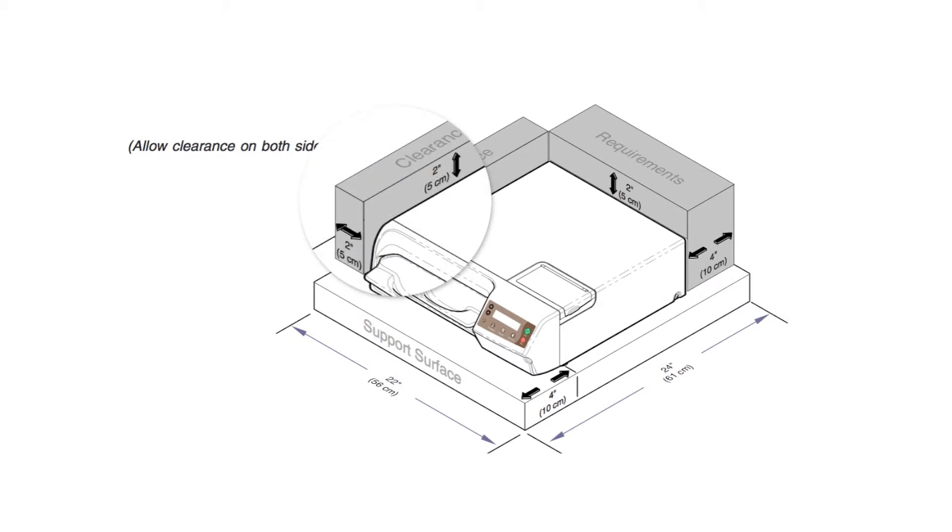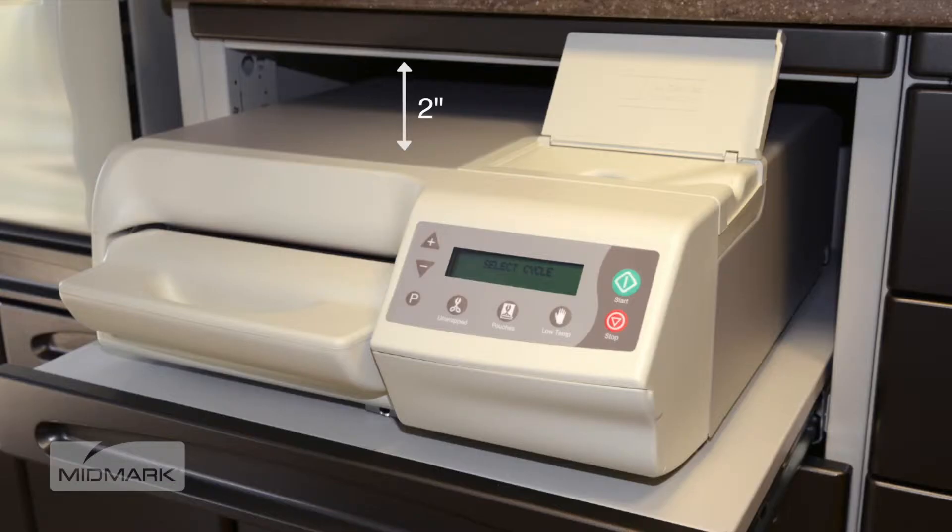If installing the unit beneath a cabinet, shelf, or overhang, a minimum clearance of 2 inches must be maintained above the unit. This is the minimum clearance for proper air circulation. However, be sure to allow access to the reservoir fill port located on top of the sterilizer.